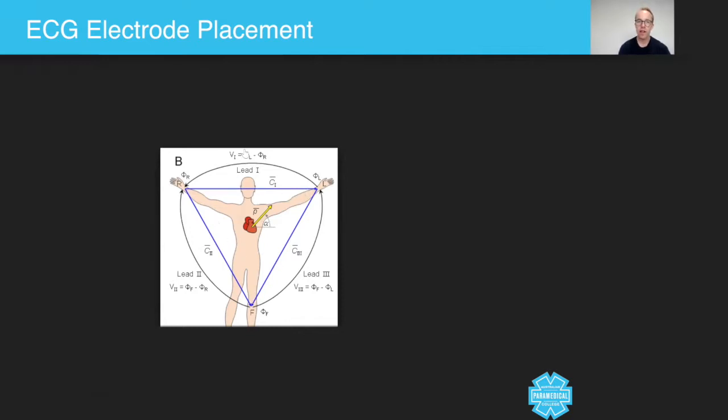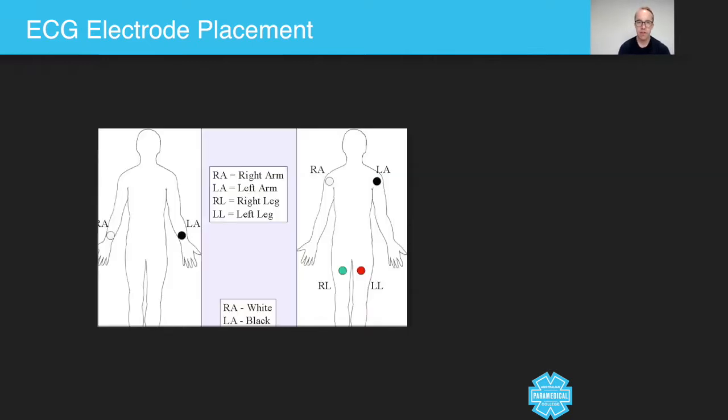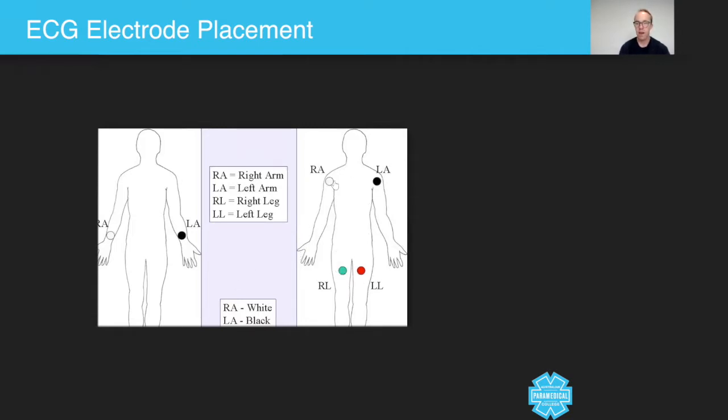So let's have a look at a number of other images. So look at this one here. It shows you that you can either put them on the right arm, left arm, right leg, left leg, or you can place the same leads on the actual patient's body as well.